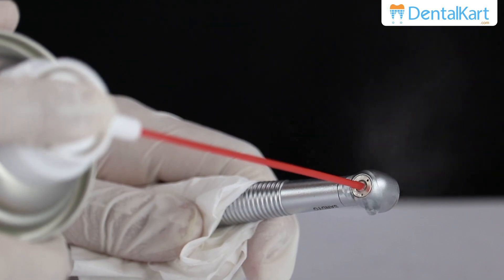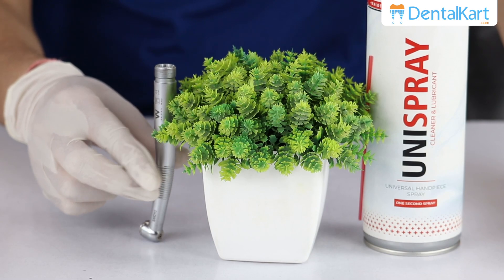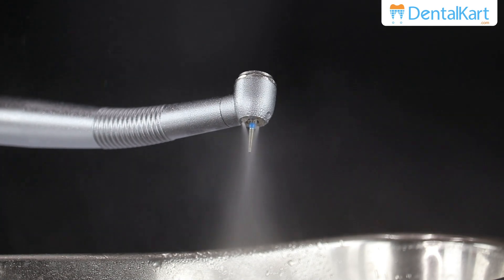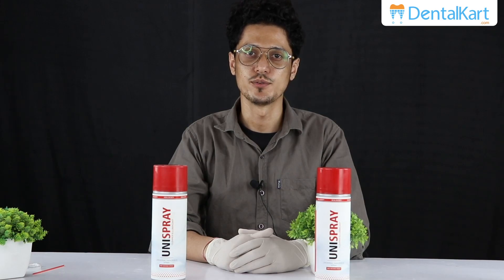After lubrication, place the turbine upside down. After proper lubrication, run the dental handpiece for 10 to 20 seconds to expel debris and remove excess lubricant.